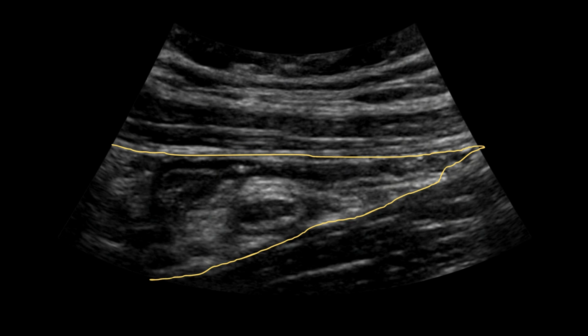The middle layer is the right iliac fossa. This is where the appendix is seen. Your job is to find the blind-ended tubular structure in this area. The appendix is not very deep. You should look for a tubular structure close to the anterior abdominal wall.